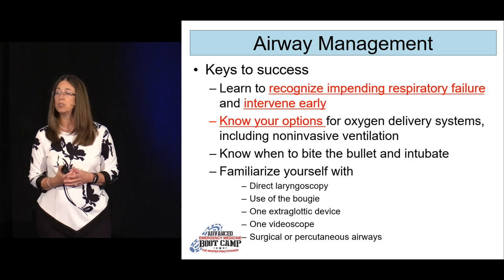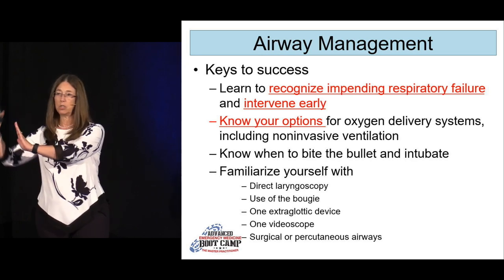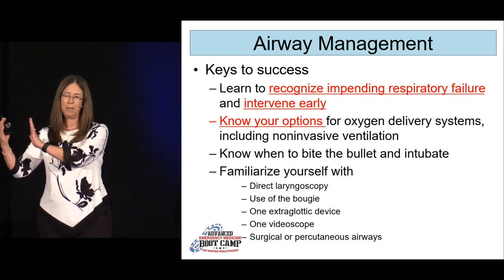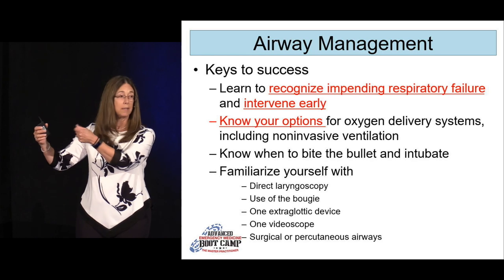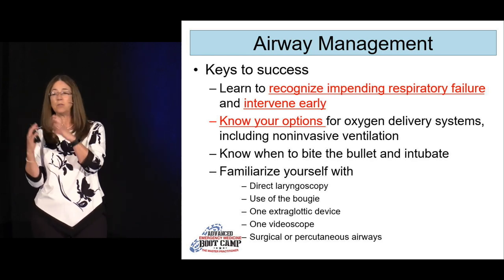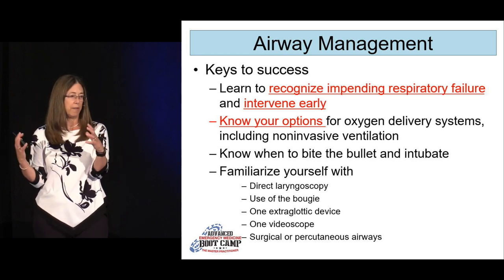When it comes to oxygen delivery, you have a range from nasal cannula oxygen, which delivers maybe up to maybe 30% FiO2, maybe it's more like in the high 20s, all the way to a Venturi mask, where we can actually tell exactly how much oxygen you're giving. A simple face mask, which if you have them in your ER, please go home and throw them away. There is really no role in emergency medicine for a simple face mask.